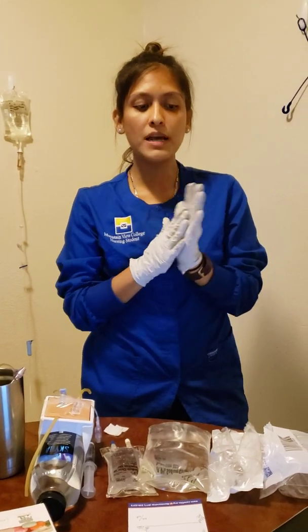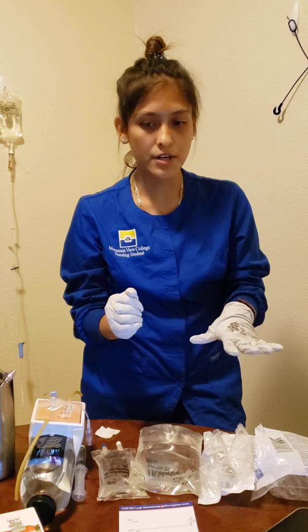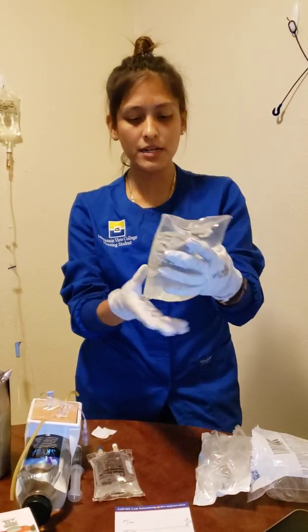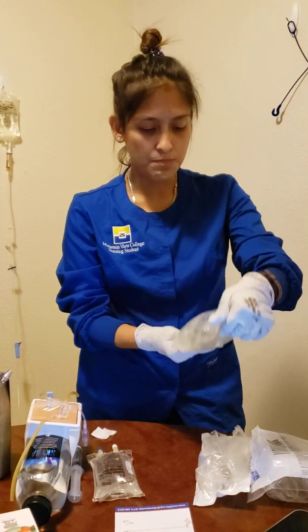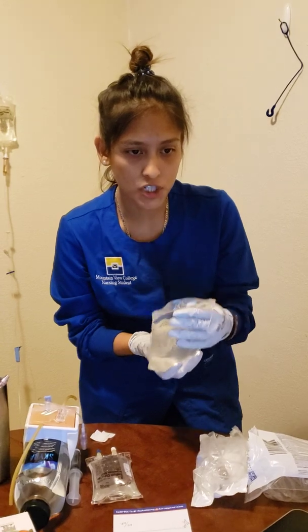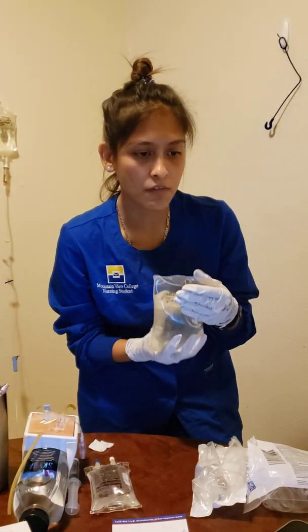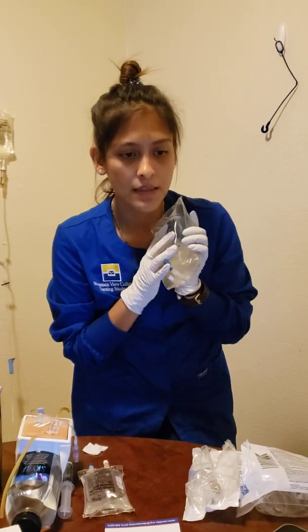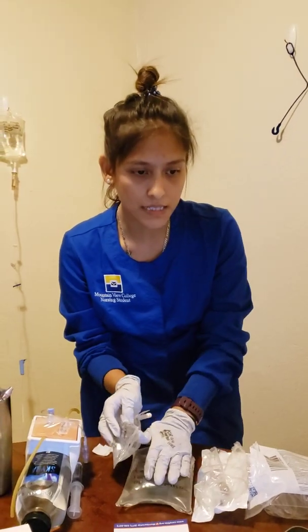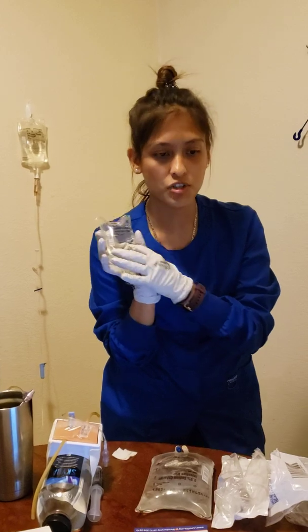So I performed hand hygiene and I'm grabbing all of my supplies. Nothing is expired, everything's brand new. I grabbed my saline here, there's no holes, it's not expired. I'm doing my first drug check. So again, I want to make sure this is for Miss Wanda Chi, 9/20/19XX, 8 o'clock, 500 ml of saline to give over 10 hours. And I have my 8 o'clock ampicillin, 500 mg to infuse over 30 minutes. And it's actually in a 100 ml.